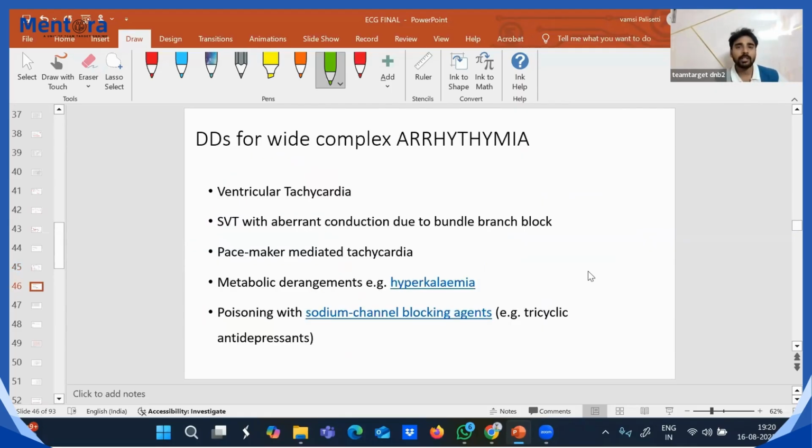Right. This is an important question they're asking. Why I'm discussing this ECG extensively is that ECG is not like an X-ray; they won't put a spotter like this. ECG is very important for the OSCE. Even out of some 25-30 questions in the OSCE, they're asking 3 to 4 questions on ECG. They're putting a simple ECG or giving a clinical scenario, asking you to identify it, how to differentiate it from other things, and what the management is. So this is what we are discussing in today's class. All the management we will also discuss. That is why I'm extensively covering ECG. In just 1 minute you have to identify the ECG. That's why I'm giving all these important, easy flowcharts.